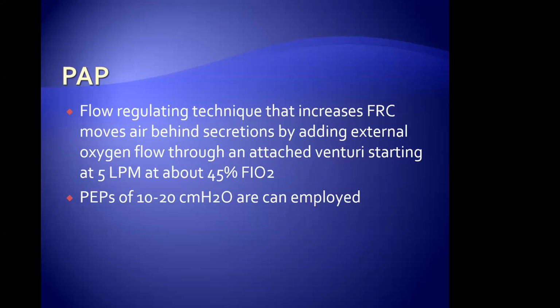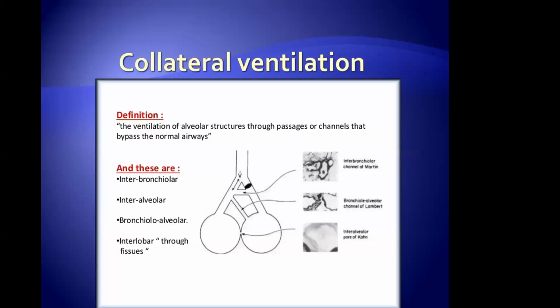Again, we're wanting to do what's very best for the patient that we have the privilege to take care of. All right, so here's the graphics. The definition: ventilation of alveolar structures through passages or channels that bypass the normal airway. So if you remember this in school, here it is.